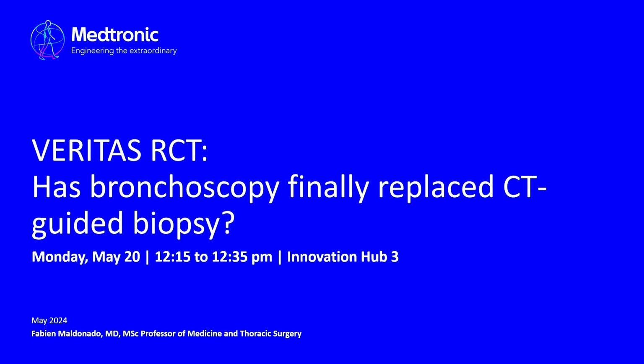What this study really aimed at looking at is whether the new version of what the actor formerly known as Super D, which is Illumisite, which is essentially a combination of electromagnetic navigation and digital tomosynthesis, which helps correct for CT-body divergence, I'll talk about this in a little bit, whether that resulted in sufficient incremental diagnostic yield benefit that now we can probably discuss whether we're as good as our interventional radiology colleagues. So kind of an interesting study, certainly something that when I trained back in the old ages was inconceivable, that we would someday reach a level of diagnostic yield with bronchoscopy that approaches that of CT-guided biopsy.